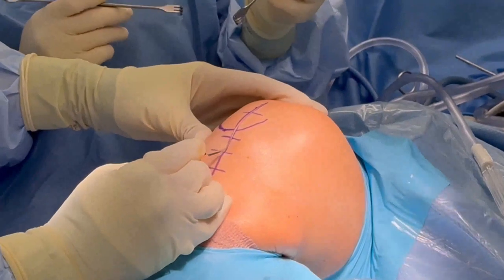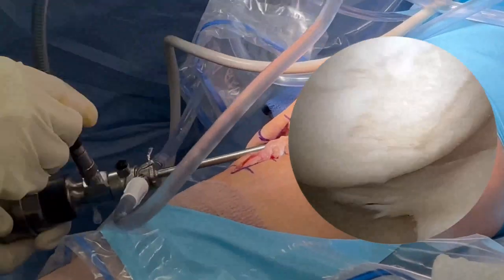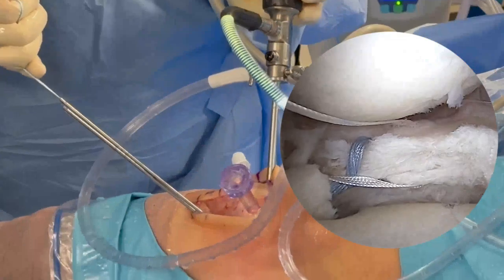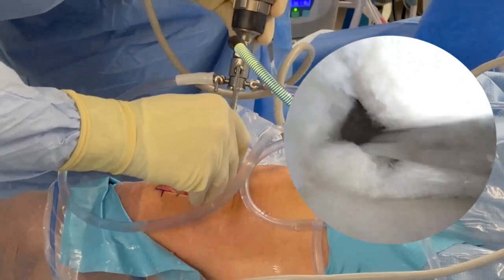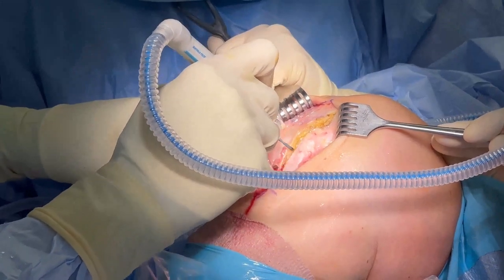A medial parapatellar incision was made, and high anterolateral and anteromedial ports were created. Grade 4 changes were confirmed in the medial compartment on the tibial side as well as the medial femoral condyle. A full thickness root tear was also identified. The root tear was addressed first and repaired using the transtibial double tunnel pull-out technique to enhance stability and anatomic restoration. To begin resurfacing, a medial parapatellar arthrotomy was made.